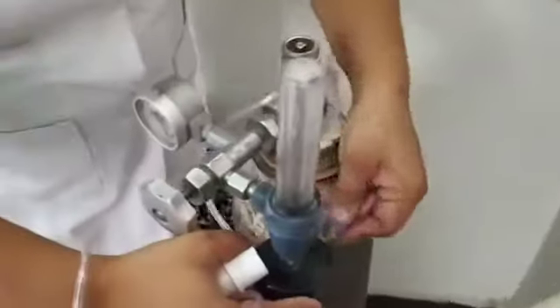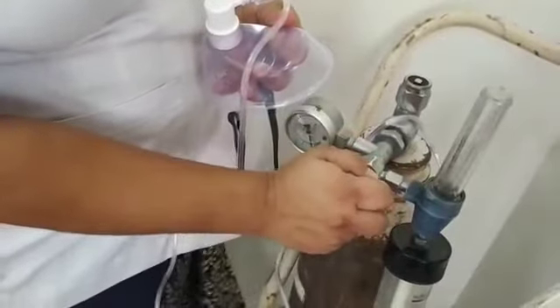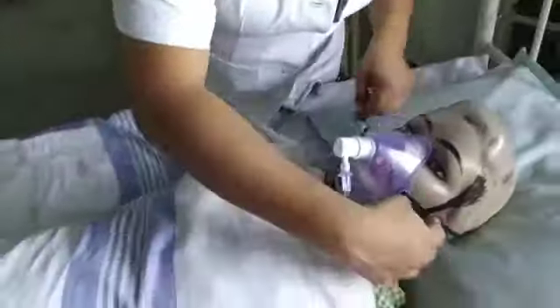We have to connect one side of the tube to the cylinder, and before giving the mask to the patient we have to set the flow rate. We can give oxygen at liters per minute — we can give 4 liters, or if prescribed more than 4 then we give accordingly based on the patient's condition. Then we put the mask on the patient's face and check that it fits nicely.